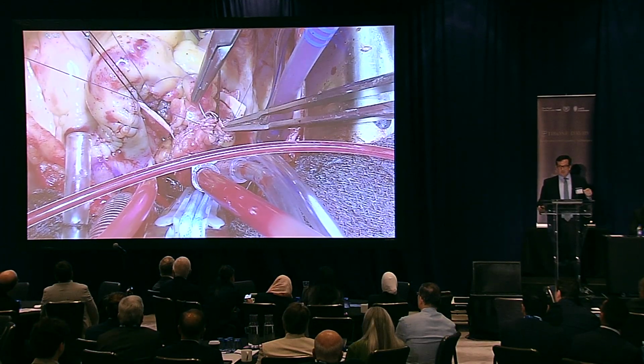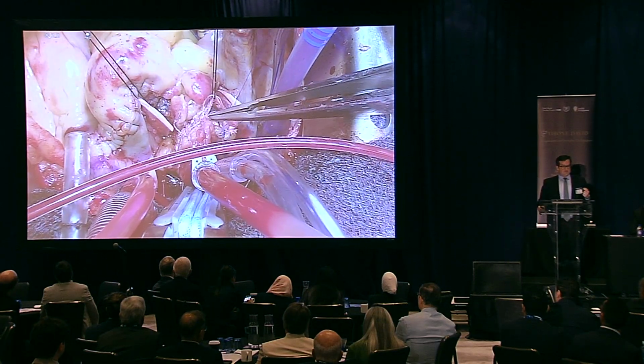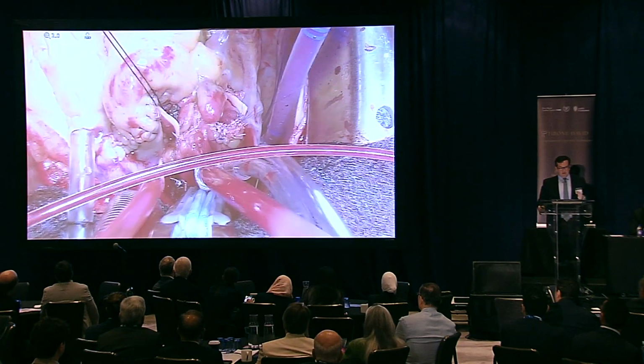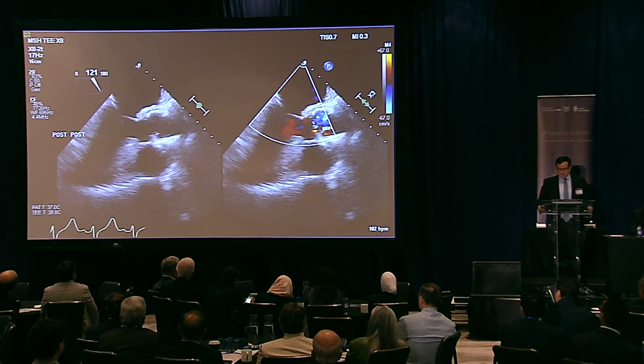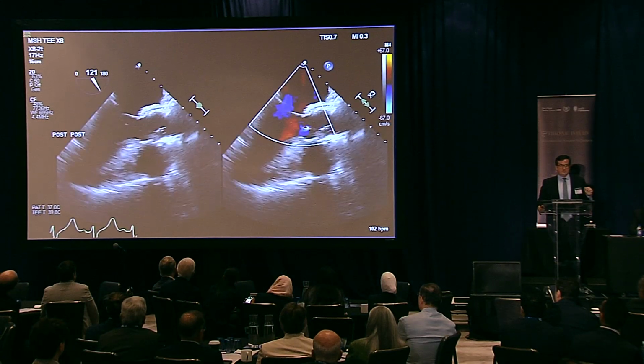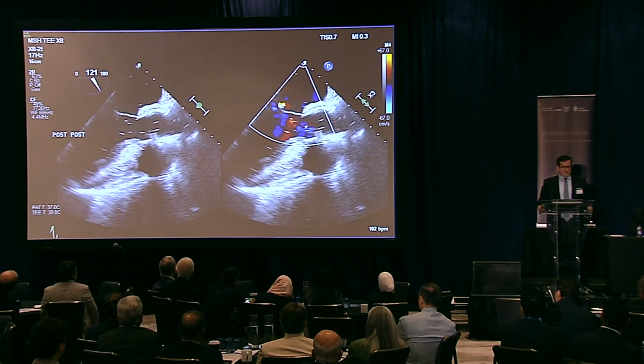We did not open up the anastomosis, the Dacron to autograft. That's a very fragile anastomosis, as Jordan touched on earlier. It's not something we want to do multiple times. So we open the graft or the aorta above. And you can see after repair, now we have lost that eccentricity. It's now that trace central jet, and this is something that we're much happier with.